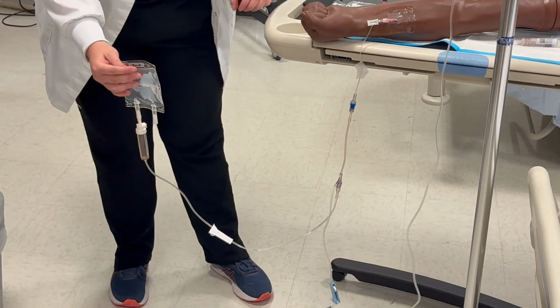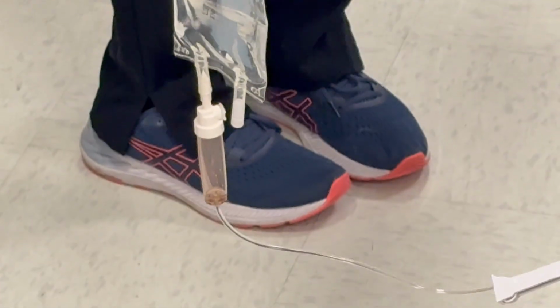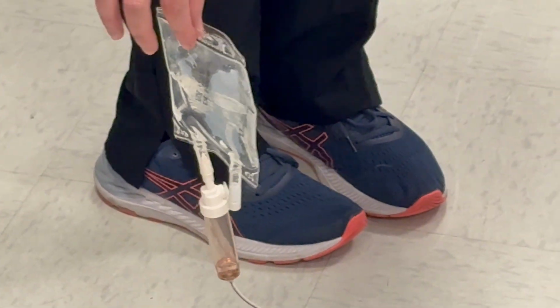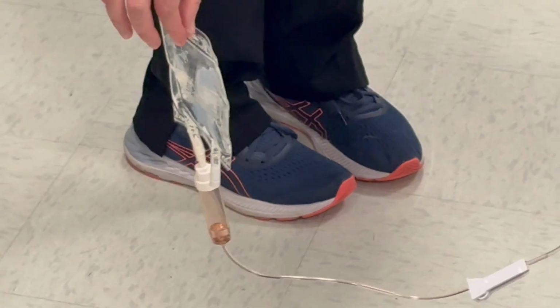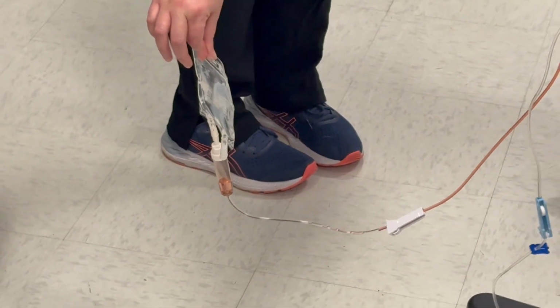It'll be much easier for you guys. See, it's right here. The lower you hold it, the faster it goes. You guys will not have to hold it this low. And I wanna hold it down there until I'm halfway full. And again, because my port is so low, blood is backing up. This will not happen to you guys, I'm sorry.